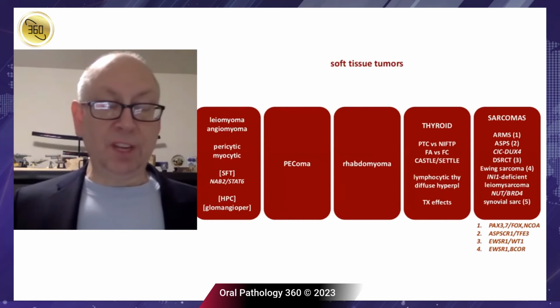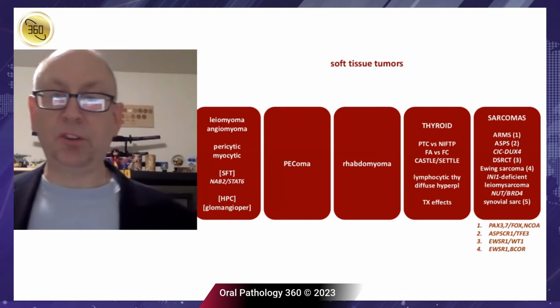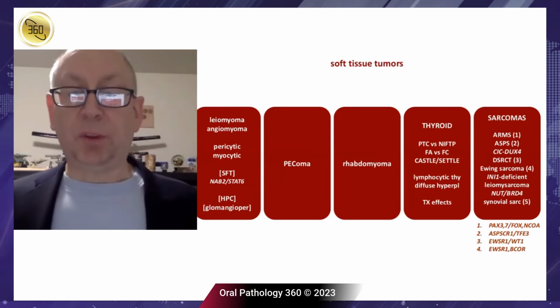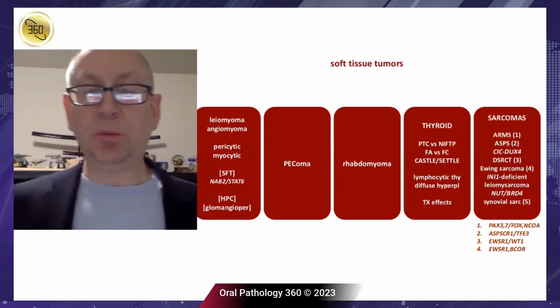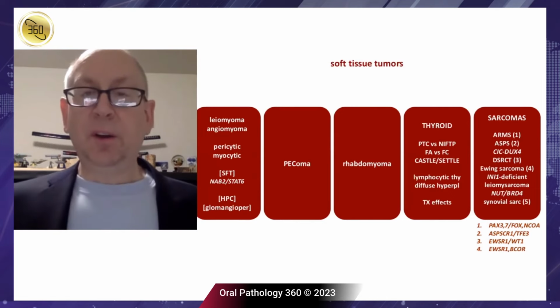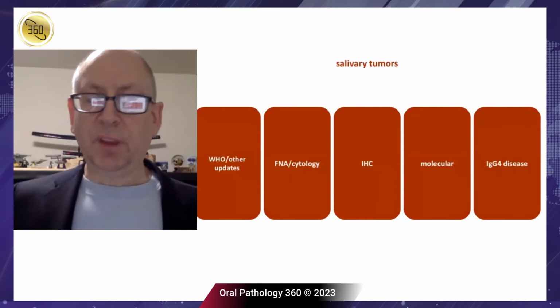I don't see very many of them, but we know they exist. Then there's benign skeletal muscle tumors. And then there are, at the right, malignant skeletal muscle tumors and malignant soft tissue sarcomas, many of which now seem to have a genetic component to them. And because the thyroid is in the head and neck, I'm going to show you some thyroid cases and show you what I've learned about them.